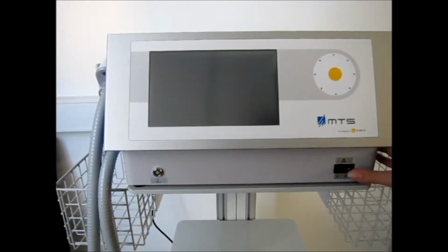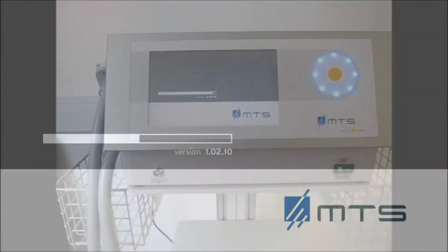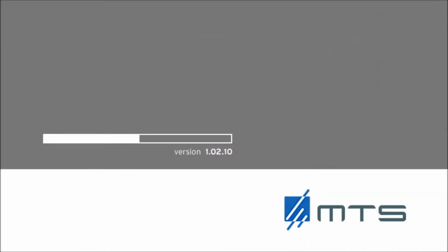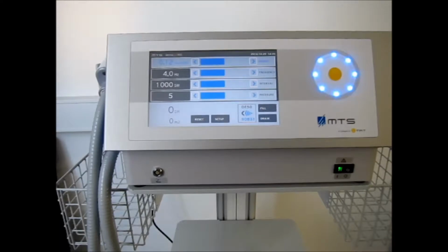Flip the main switch to turn on the device and wait until the small light stops flashing. Then, press the yellow confirmation button and hold for 2 seconds. While the device is booting, it displays a start screen giving information about the current progress and software version. As soon as the operating screen appears, it can be continued.